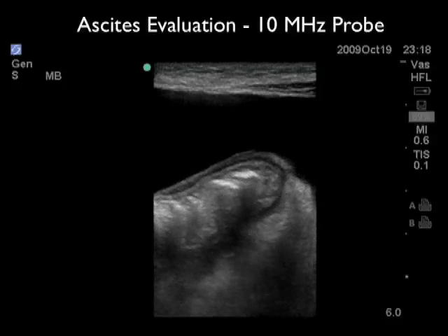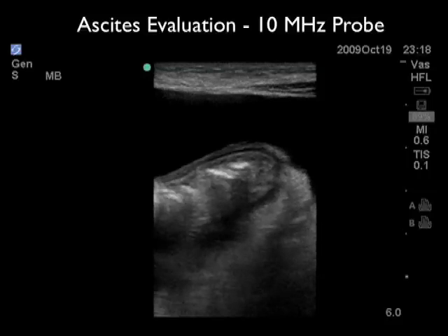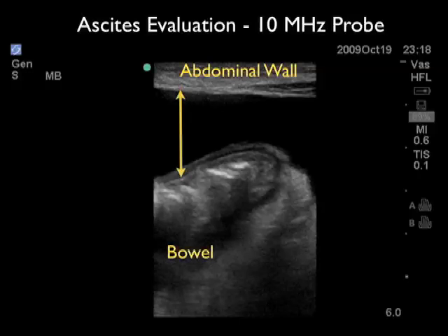This video clip emphasizes the point that using a higher frequency 10 megahertz probe on the abdominal wall gives a more detailed evaluation of the ascites in relation to the intestine. We see the abdominal wall anteriorly and can see the bowel floating within the ascites. Here we can actually mark down and measure the safety zone in which a needle could safely pass through the abdominal wall into the ascites without hitting bowel — note here the safety zone is approximately 2 centimeters, as marked out with the centimeter dots.